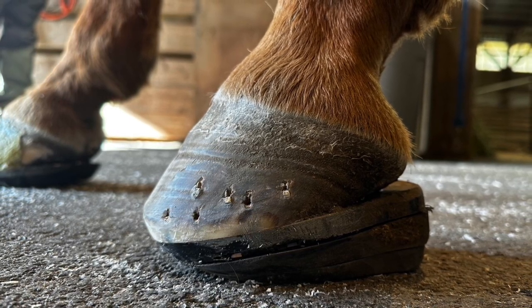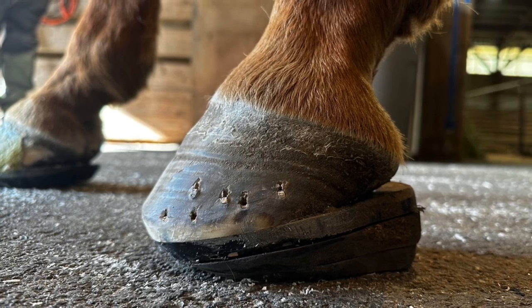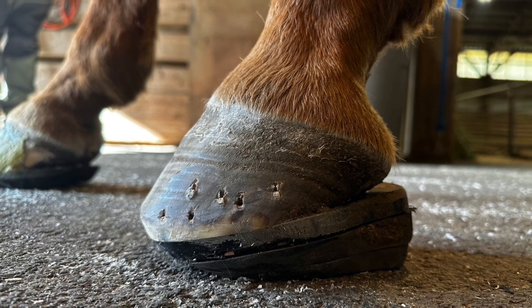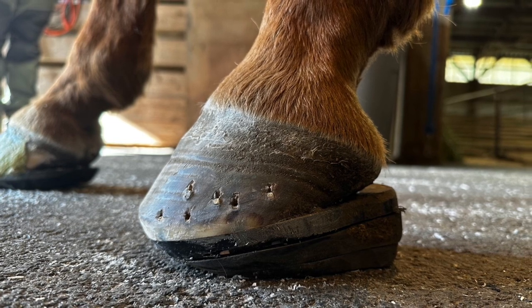This horse had a severe injury to its deep digital flexor tendon, and at the vet clinic this is the apparatus we came up with: we nailed on a hard double nail pad and then used urethane wedges to achieve the desired mechanics needed.